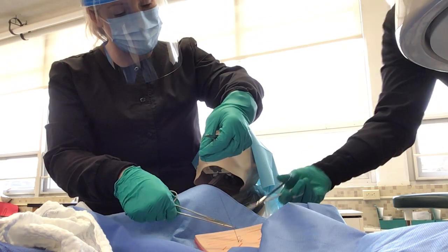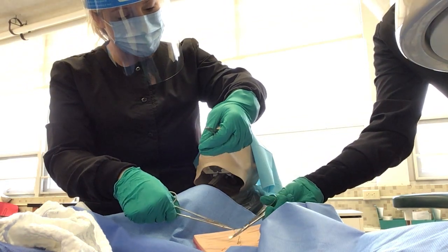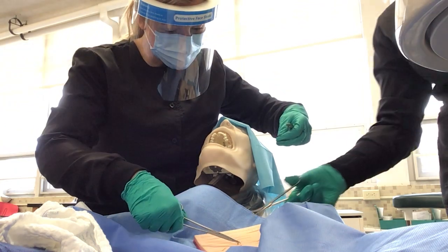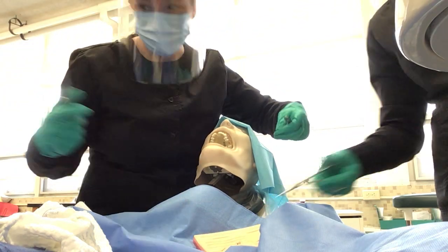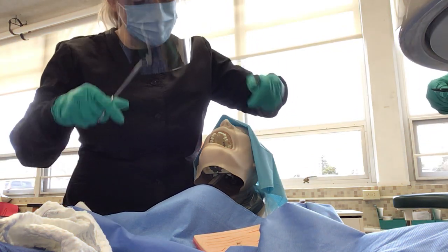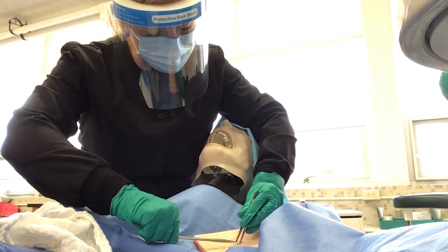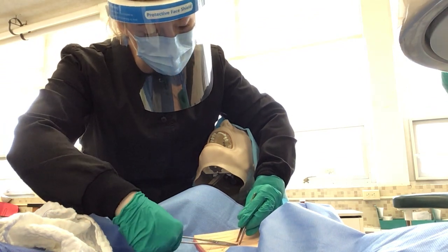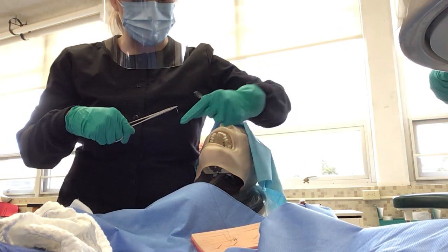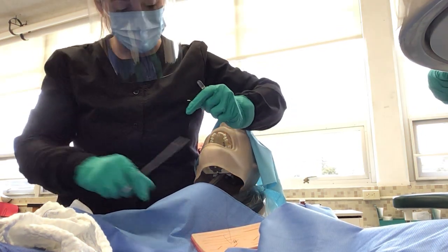Okay, we're gonna cut. So you want to try and cut as close to the knot as you can so we don't leave a whole lot to irritate that patient's tissue. So we're gonna put four sutures in there for you to remove. You'll practice ahead of time. When you do it this day, this will be your performance exam, okay, when you remove the four sutures.